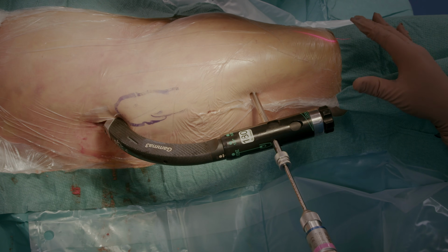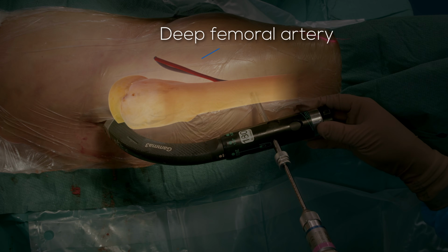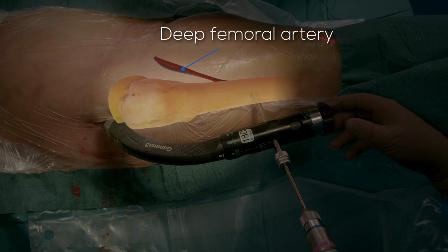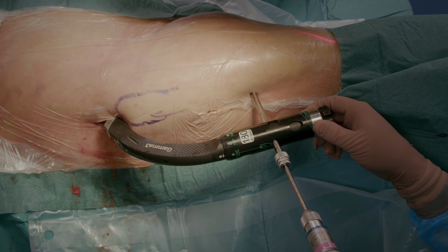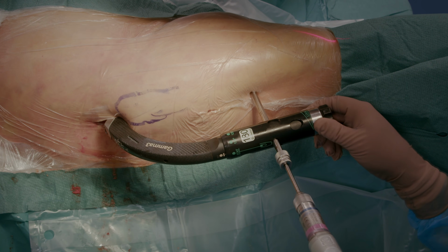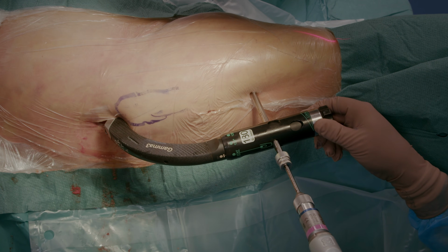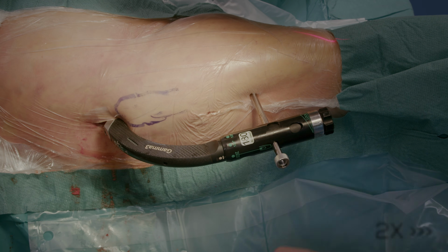Next, we start drilling. It is important to remember that there are vital structures on the medial side, such as branches of the femoral artery. Drilling of the medial cortex needs to be done with caution to avoid unnecessary damage to the medial soft tissues and blood vessels. You can drill under fluoroscopic imaging, and when you have gone through the medial cortex, take the reading from the drill. In this case, we select a 40 millimeter long screw.